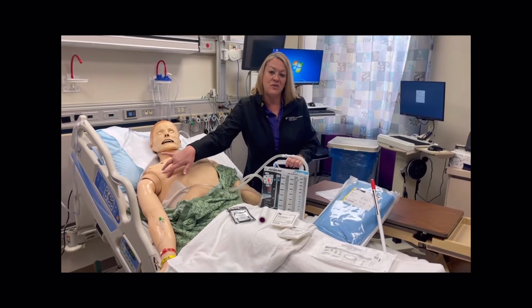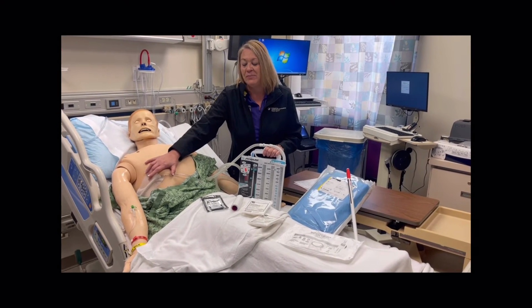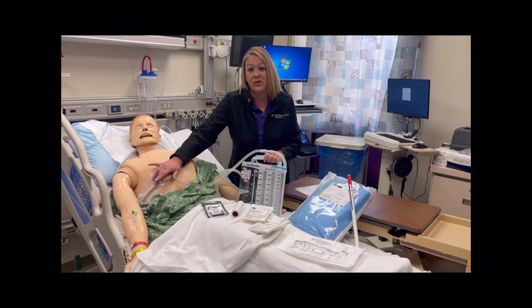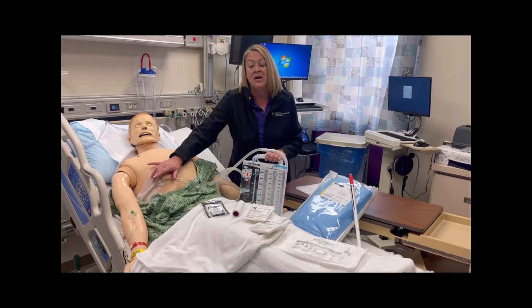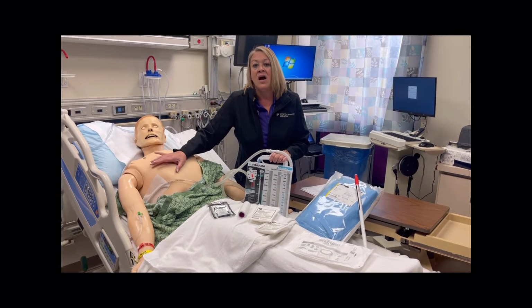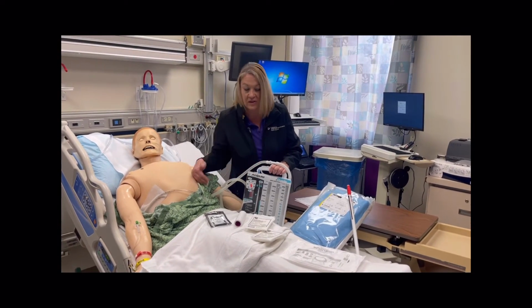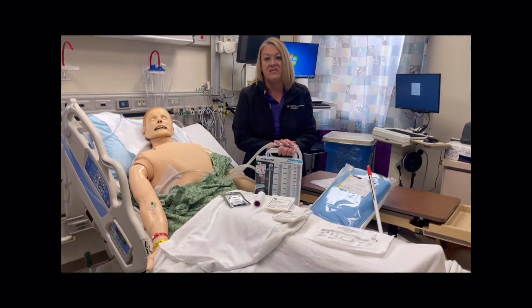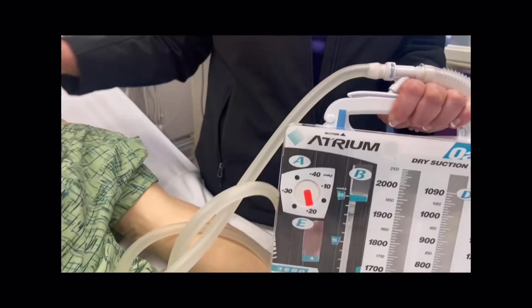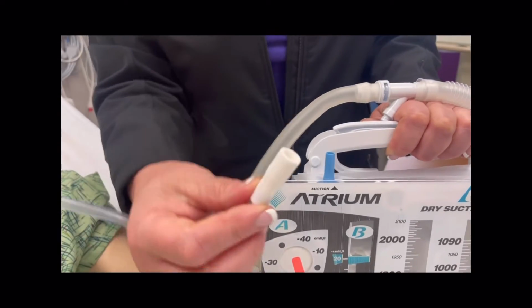All right, some final notes. Let's talk about weaning. The whole point of this is to get this out of the patient, right? So your provider's gonna have some weaning parameters and orders. Typically what they'll do is they'll place the patient on, sometimes they'll decrease the suction like to 10 centimeters, but often they'll just go straight to a water seal. And what a water seal means is this is all still in place, but it's not connected to suction, so that the water seal is the only thing that's managing the pressure in the tubing line.